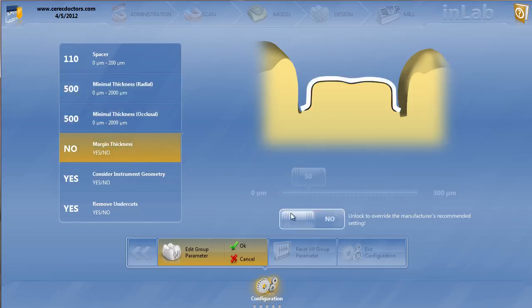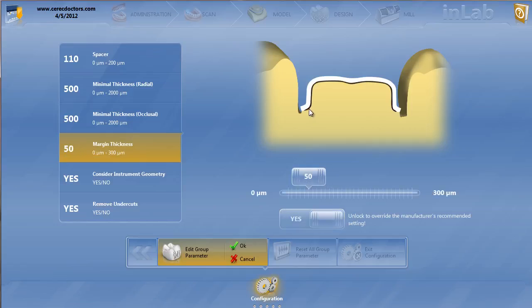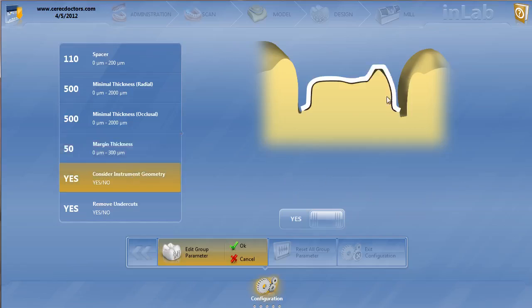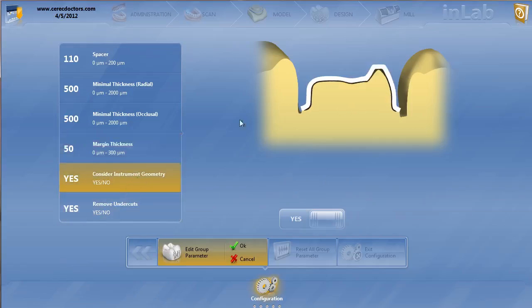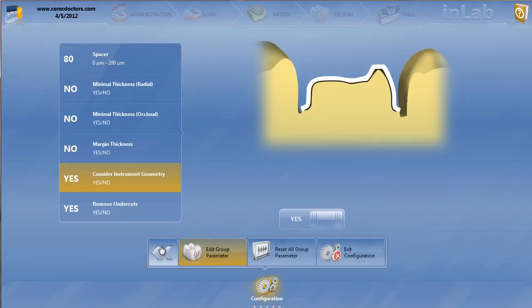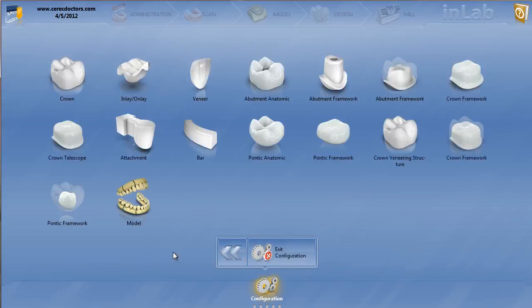Margin thickness, I like to keep that a little bit thin because sometimes I'm actually drawing the margin short of the actual margin by a little bit and then re-prepping over the top or re-imaging. So the margin is not too important, so I usually keep that a little bit thin. And of course, we want to keep our instrument geometry and remove undercuts always at yes. There's no need to actually have binding spots. So we'll go ahead and go back to the next one. That's crown framework.